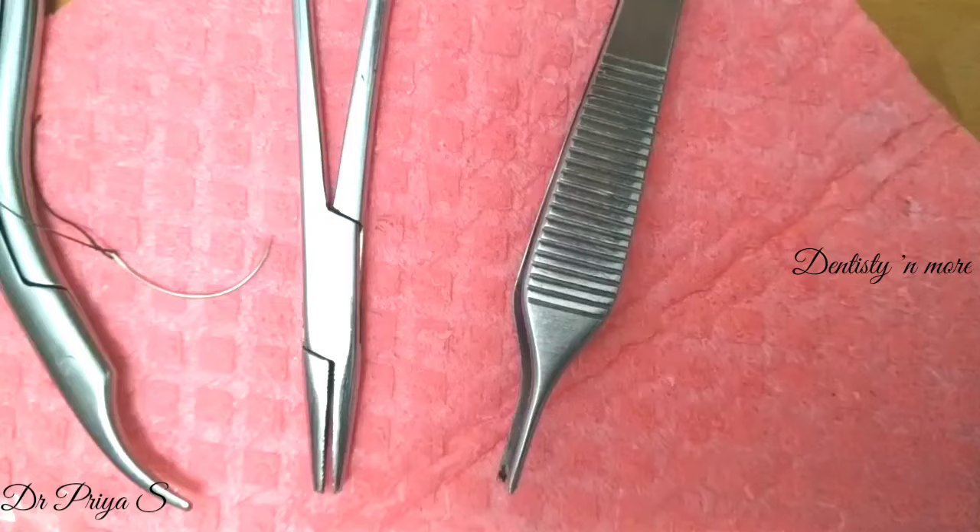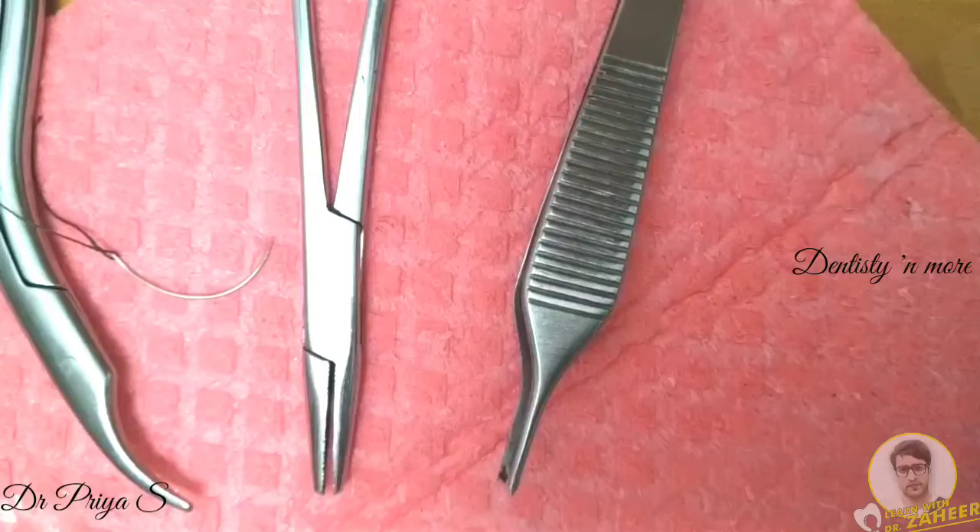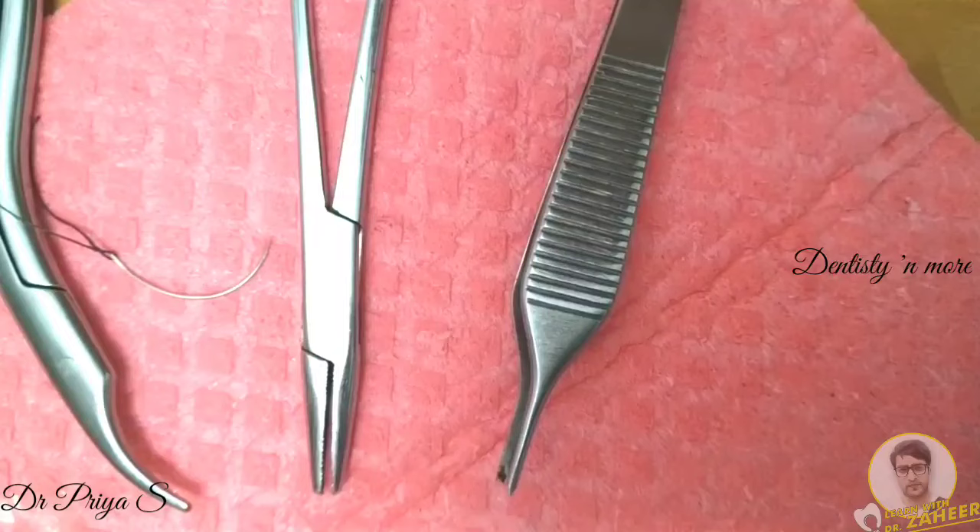Hello everyone. In this video we are going to learn the different suturing techniques practiced in oral surgery. The first suturing technique is simple interrupted suture. This is the most widely used technique for skin as well as oral mucosal closures. It is called interrupted because the sutures aren't connected — they are separate, so even if one suture fails, the others hold the wound in place.